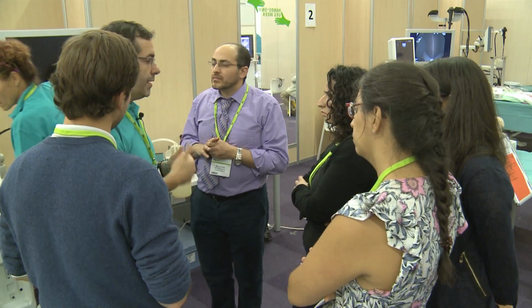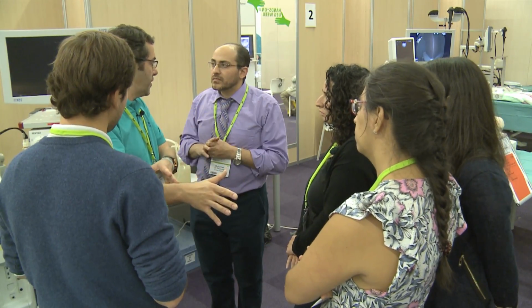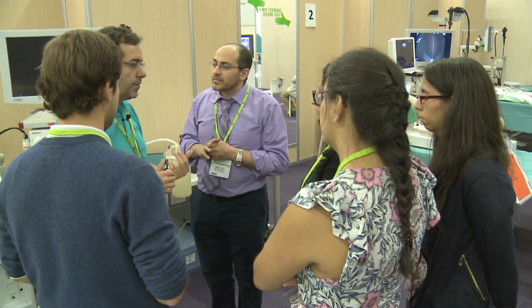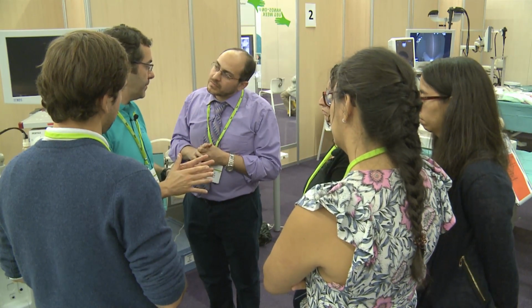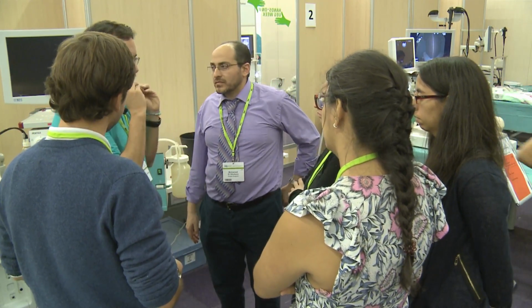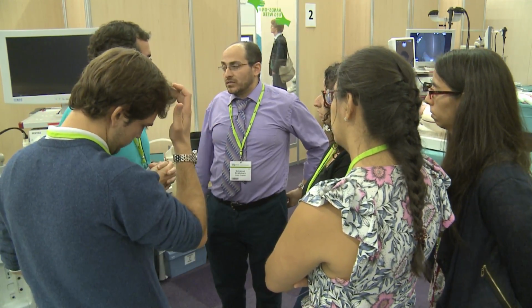We will go for a thoracic and abdominal CT scan. Is there any other additional lesion? We will make one strategy. Is the only lesion a subepithelial mass? Then what is the size? If it's below 2 centimeters, very good looking, probably we do a straight follow-up. If it's from the second layer, homogeneous, with no contrast enhancement and with a normal elastography, follow up.